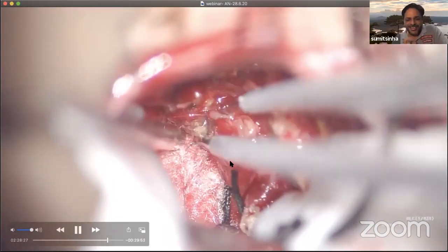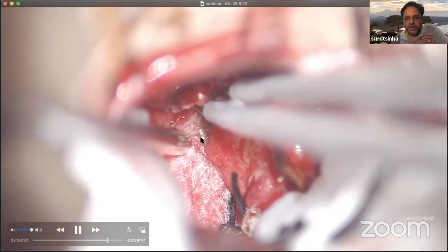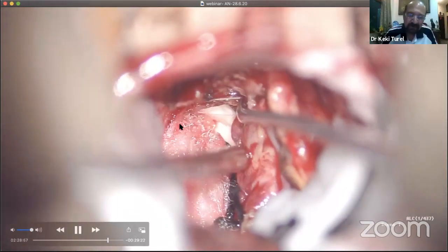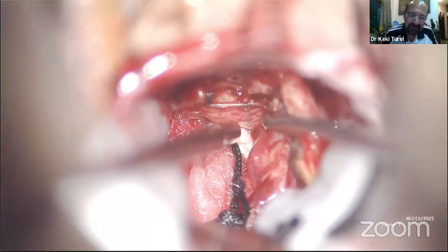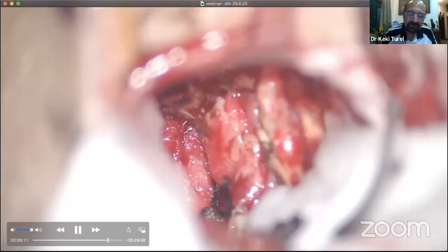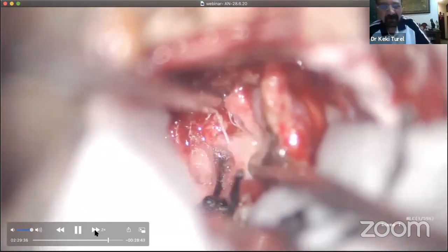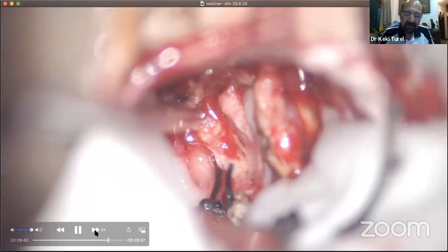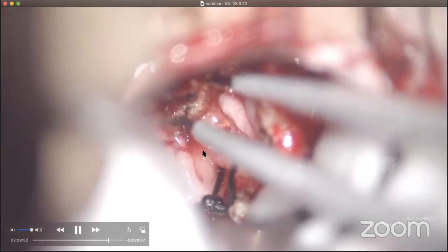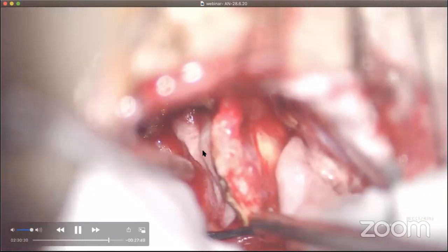The dissection of the tumor pole is complete. That is what you just saw, actually. So if the tumor is large and obscuring the view of the canal, you may debulk the tumor at the beginning. If the tumor is small and you can visualize the canal very easily, then you can start from the canal. So it depends on the size of the tumor and the way it covers or obscures the view towards the canal. Yeah. I am first asking about a large tumor, ranging at or above 35 millimeters.